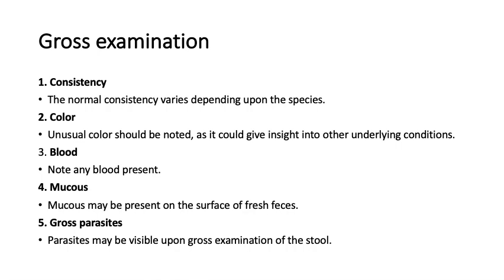Upon receipt of a fecal sample, a gross examination should first be performed to examine the physical characteristics. Comment on the consistency of the fecal sample, if it is soft or watery. Keep in mind that the normal consistency varies depending upon the species from which it came.